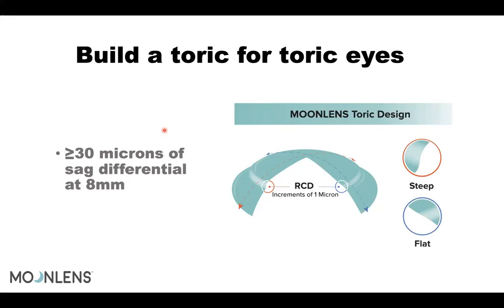I just want to be clear with you, and just so that you are aware, that correcting higher myopias is going to be a slower progression. It has been studied that correcting a -5 is going to take much longer than correcting a -1.